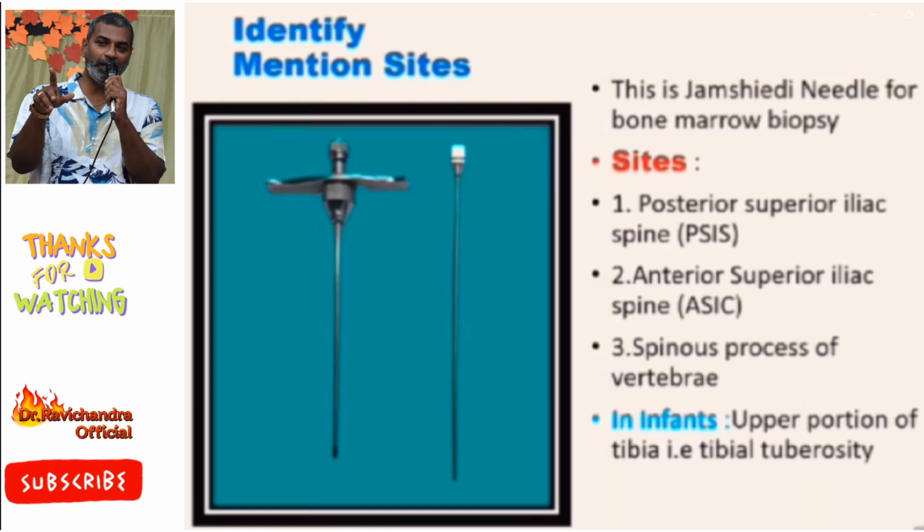Jamshidi needle, it is a bone marrow biopsy needle, and bone marrow biopsy is done at the posterior superior iliac spine, anterior superior iliac spine and spinous processes of the vertebrae. In infants, it is done in the upper portion of the tibia, that is tibial tuberosity.